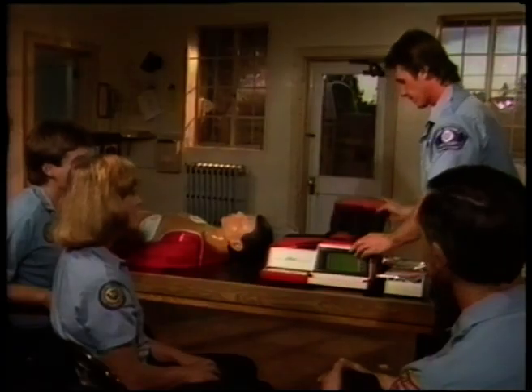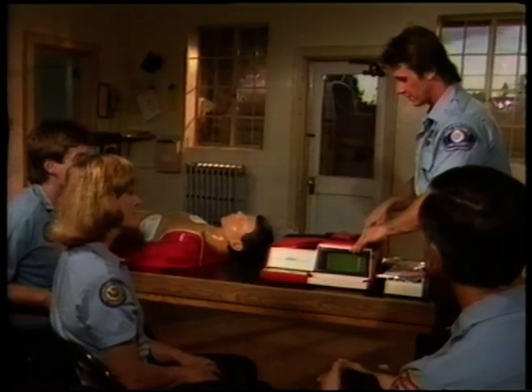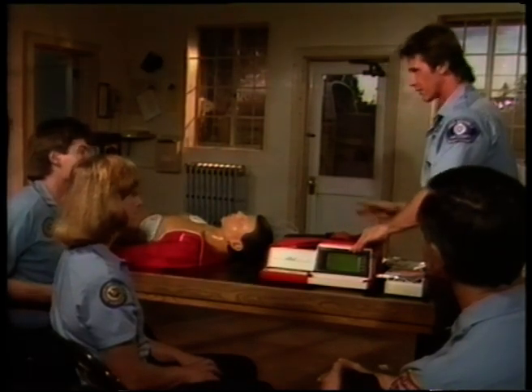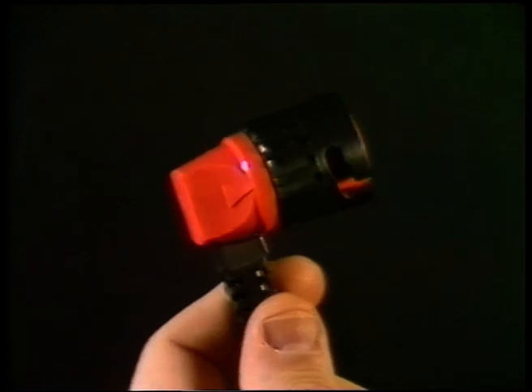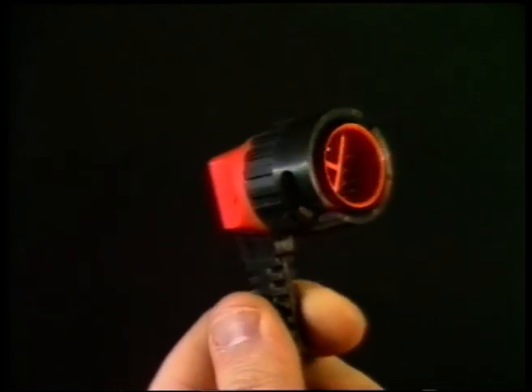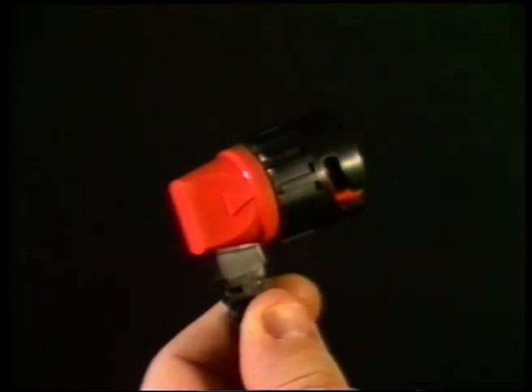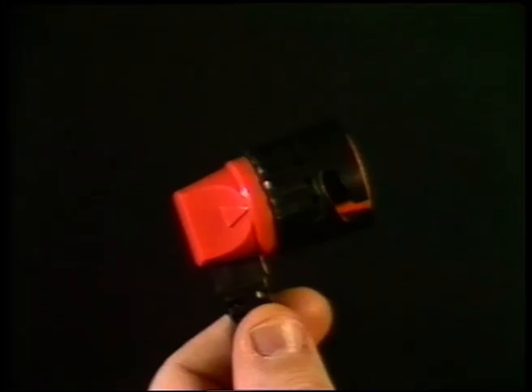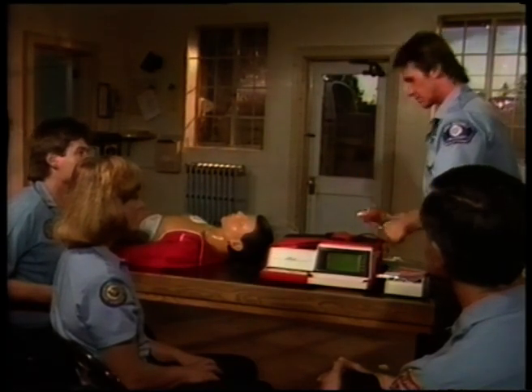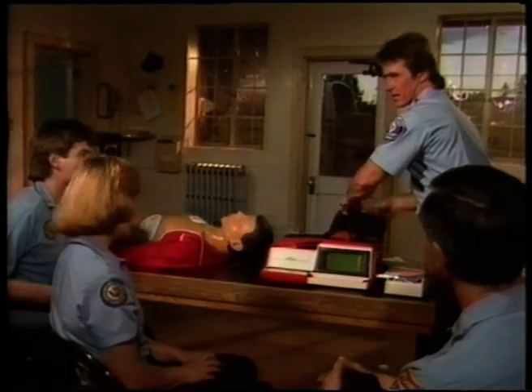Verify that the defibrillation cable is attached to the unit and not the ECG monitoring cable so that the unit is properly prepared to be used in an arrest. The defibrillator cable can be identified by its black and red device connector versus the ECG monitoring cable's all black device connector. Coil both cables and store appropriately. Replace the defibrillation electrodes. At least 2 packets of defibrillation electrodes should be available at all times.